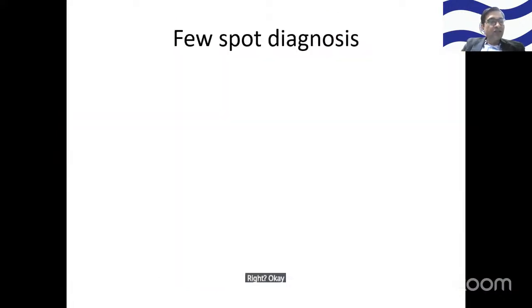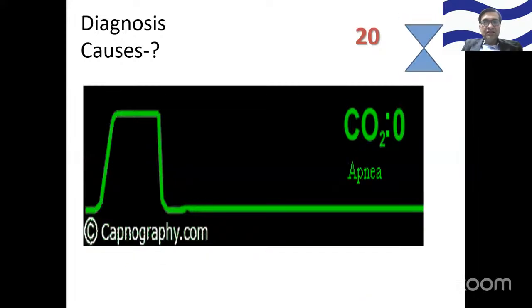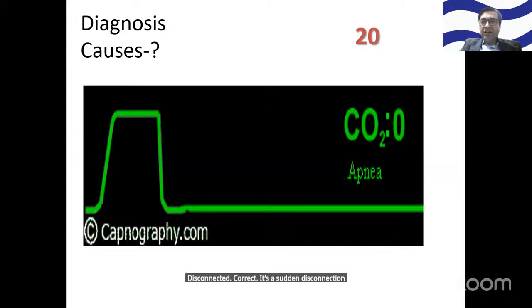Okay, great. Now a few spot diagnosis. You just have to tell me the diagnosis. I'm not going to tell you anything about this. Time starts now. Disconnected. Correct. It's a sudden disconnection because EtCO2 is dropping down to zero.